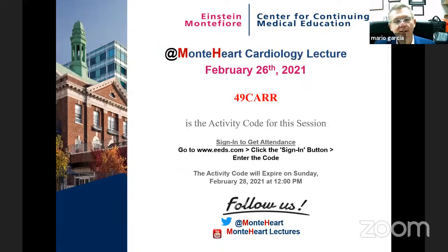One of the limitations of MRI, of course, when you compare with other functional imaging modalities for ischemia, is that it's very difficult to exercise on an MRI. Investigators have tried that. Actually, you come from Ohio State, and at Ohio State, Subha Raman at some point was working on a biking protocol for MRI. But in most places, you're right, it's a pharmacologic stress that you do.